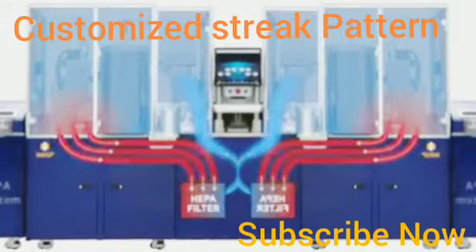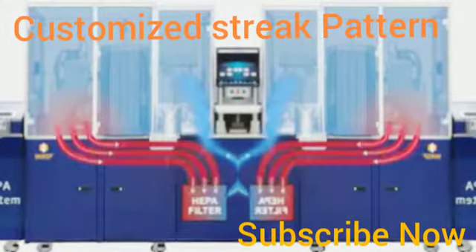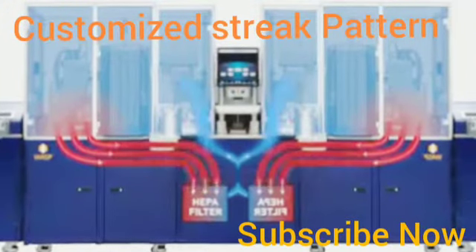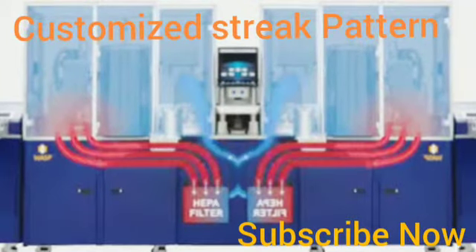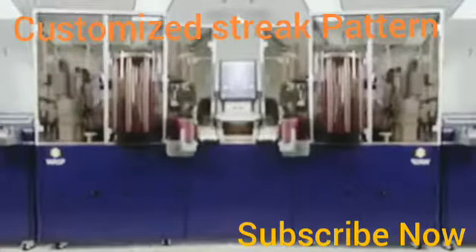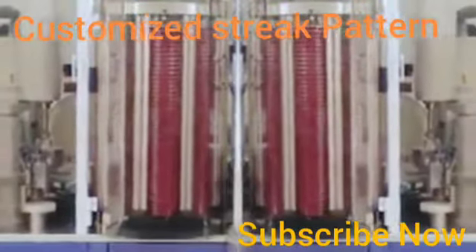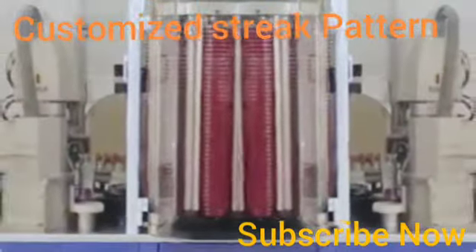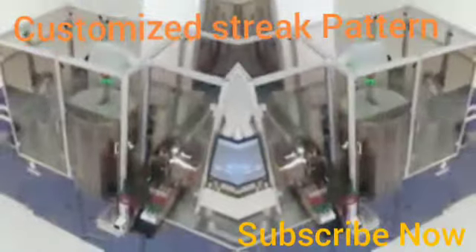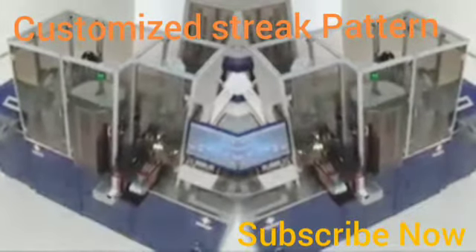The entire WASP system uses a targeted HEPA filtration system, focusing on high-risk areas where specimens are open and optimizing specimen containment and confinement. By maintaining a close relationship with the microbiology community, Copan continues to make innovative strides and has designed WASP as an open platform modular instrument for the seamless addition of new features and capabilities.